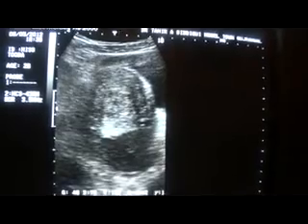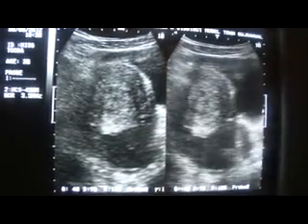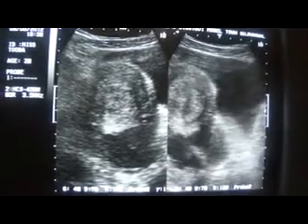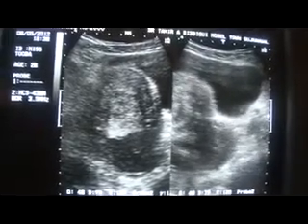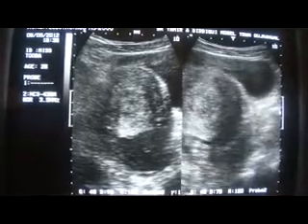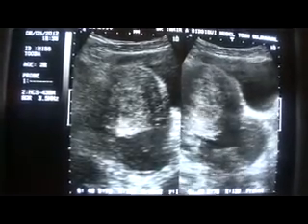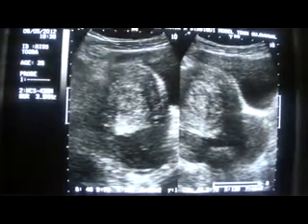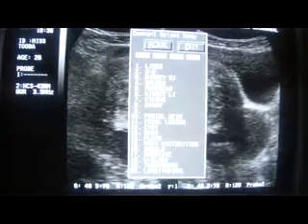Regarding the pathology relating to the adnexa, with the other ovary not being clearly visualized, this can be a ruptured ovarian cyst with loculated fluid collection. The fluid is loculated and there is fluid collection in the pelvic cavity. This is the fluid.